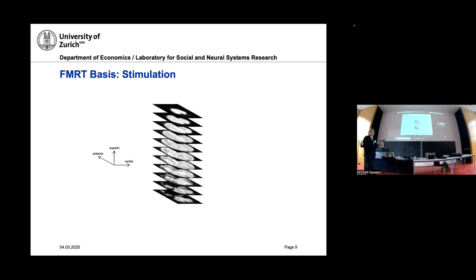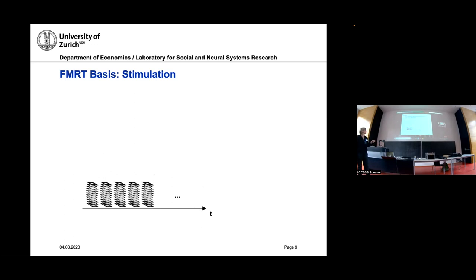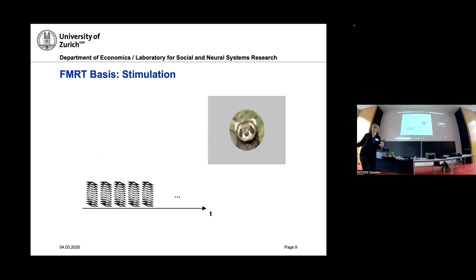And this takes something between 1 and 2 seconds. And this we repeat all the time, so we acquire many of them over time. And while we are doing it, we apply something, and this is called stimulation, and this is the same for all other imaging methods. You apply something to the participant. In this case, I've shown you some pictures, and here's a very cute one. And the opposite is a very ugly picture, at least for some.